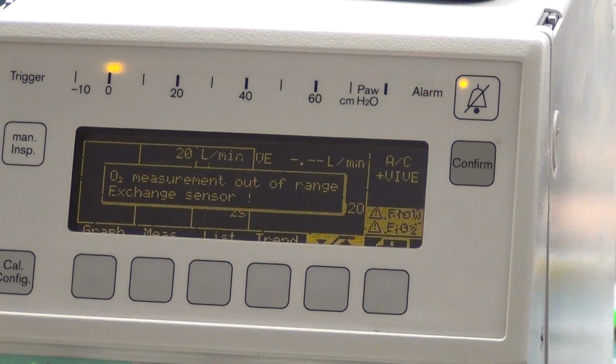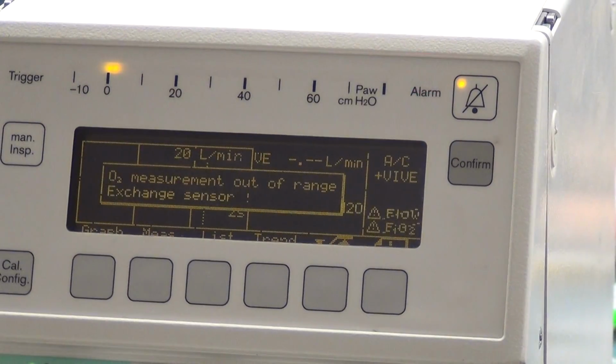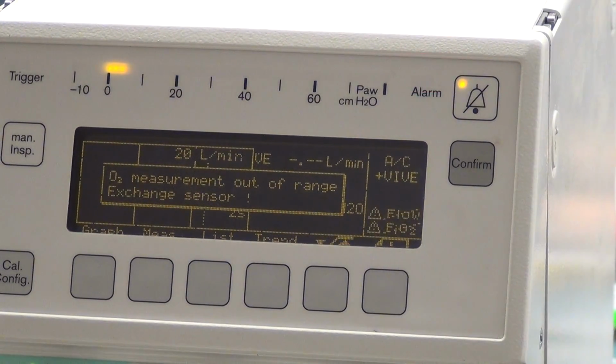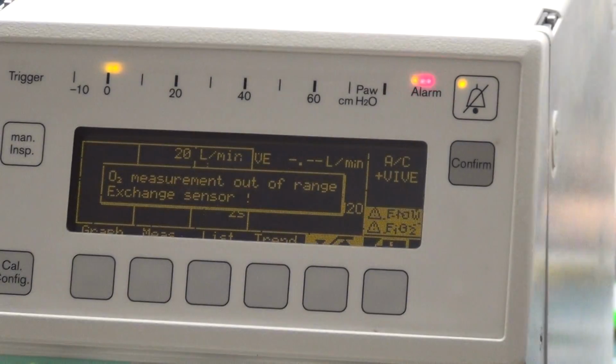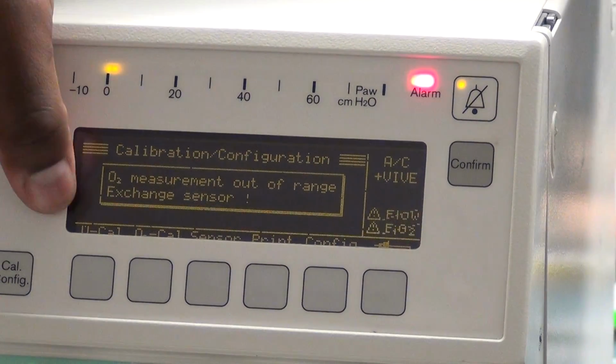Okay. All right, so now after we turn on our ventilator, first thing that happens, of course, we have all these different messages that pop up on the screen that may get in your way. We have to calibrate our flow sensor. In order to calibrate the flow sensor, we press the Cal Config button. So we do that, and then we press the VCal button.